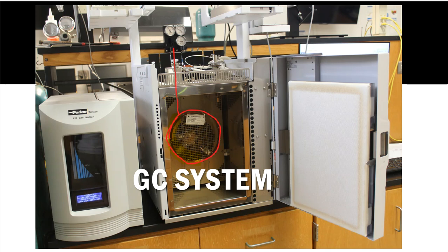That is where separation takes place. That is where our alcohols begin to separate from each other. And we have to have separation or we can't really tell how much ethanol is there because it is surrounded by all the other stuff that might come along with it. So I need ethanol on its own in order for me to do the analysis, and that requires the separation. That is the point of the GC system. It is there to separate. And if it cannot separate, folks, we can't really do any kind of reporting at all on these blood samples that we have been handed over in order to analyze.